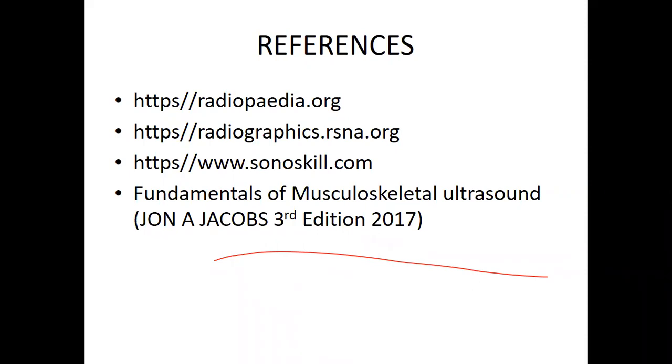Sonographically, when you have a chronic condition happening within the soft tissue, the first thing that should come into your mind is what is happening within that soft tissue. All chronic conditions present with increased echogenicity, with gradual deposition of dystrophic calcification. So for chronic cases, check for fat deposition, or calcified deposition. And then for acute, you look for hypoechoic, or it will appear edematous.